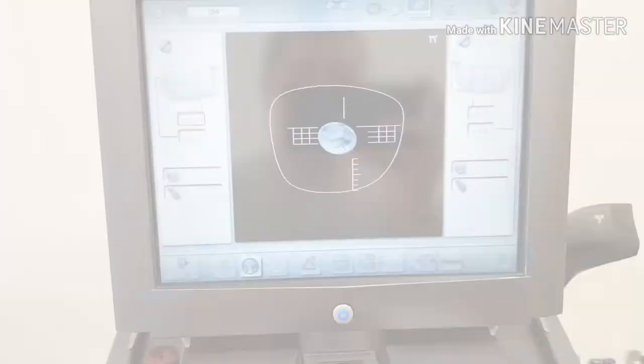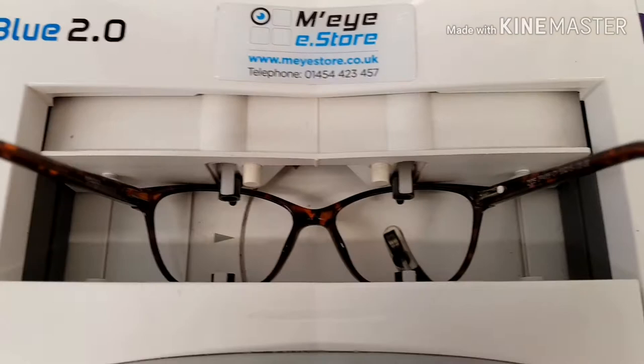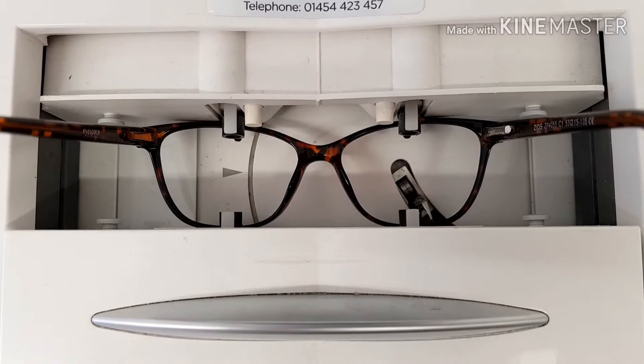Next up, we assign the job a barcode and this barcode is going to follow this job all the way around the whole process. We scan this onto the machine. And then what we're going to do is use this machine here to basically scan and read the dimensions and the shape of the frame. This machine will have a small little needle that will come up inside the frame and it's basically going to scan the dimensions of the inside rim — this is the area where we're going to be putting the lens. This machine is really, really accurate.